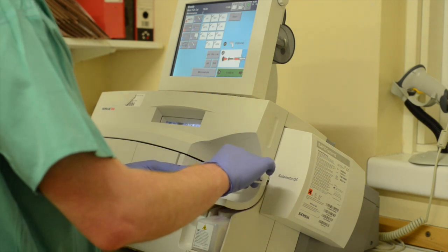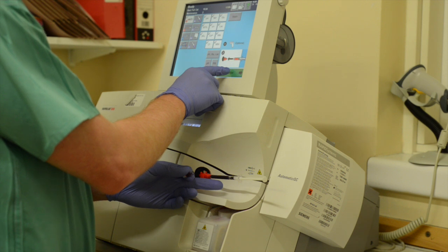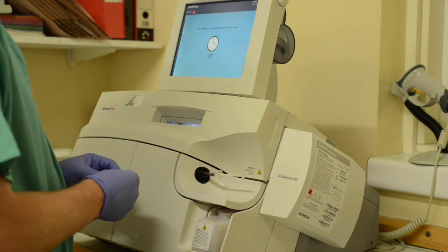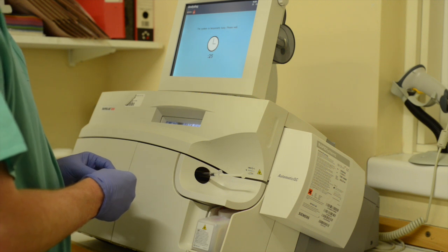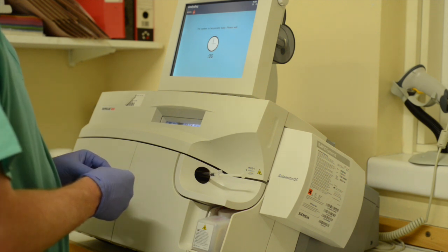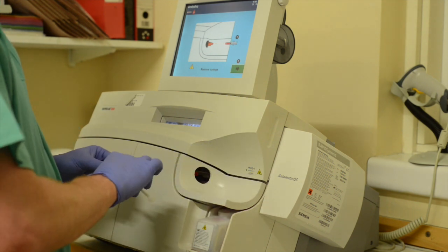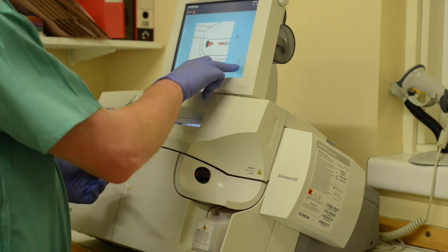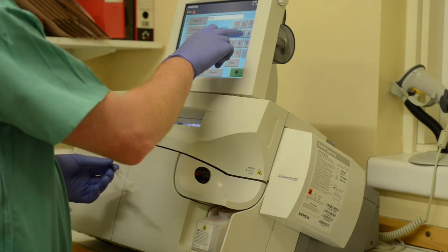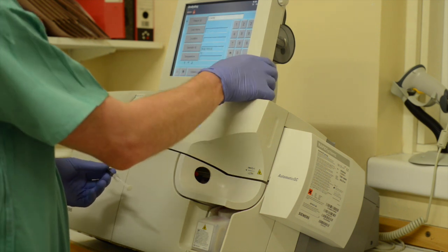Once you have access to the machine, gently insert the syringe into the collecting device. Once a sample has been analysed, a readout will be provided once the correct patient details and oxygen therapy information has been entered.